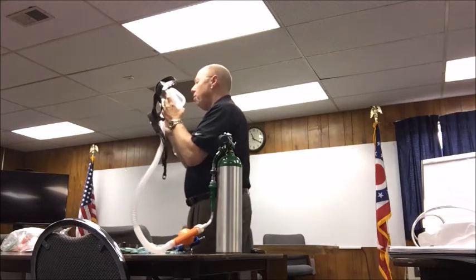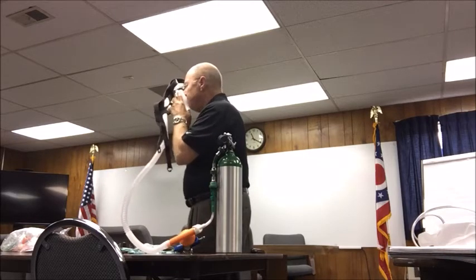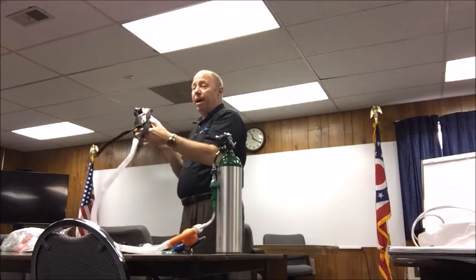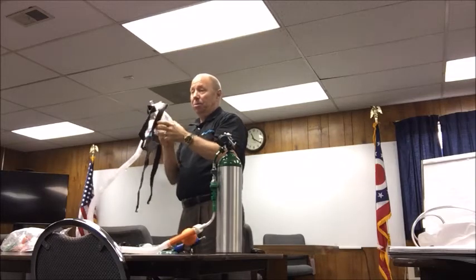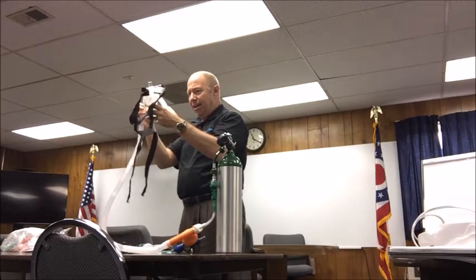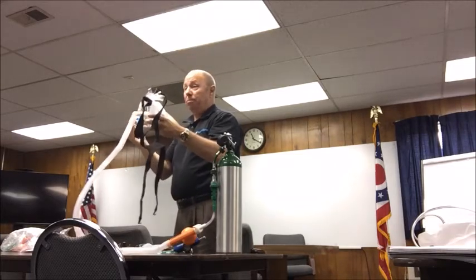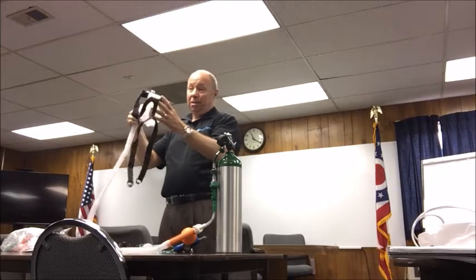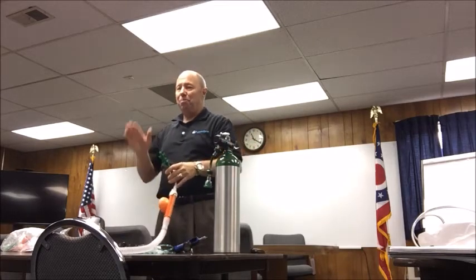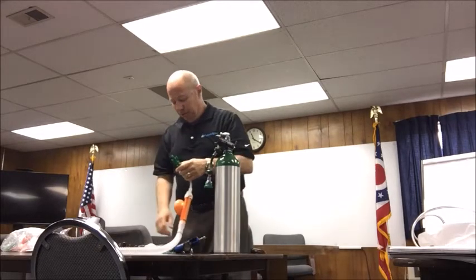Now, one of the things that's important, watch this when I breathe. This is where the oxygen, this is the relief valve. So look at it. Can you see it go up and down? There's another diagnostic tool. I'm watching the patient breathe. For whatever reason, if I lose that or don't see that, and the new ones will be orange so we can see it, you need to figure out what's going on. So that's how simple it is. Any questions about the CPAP? It's really, really simple.